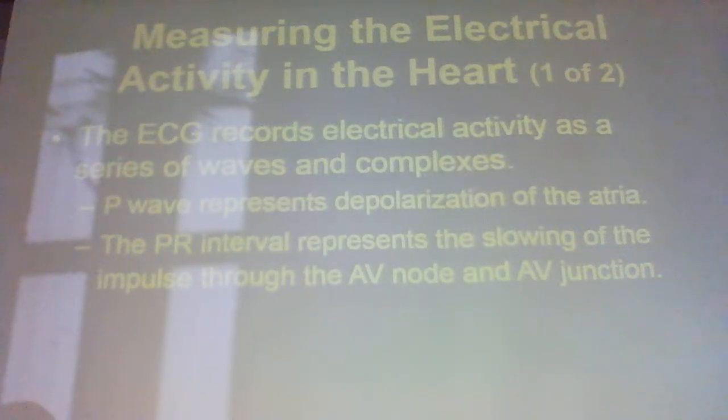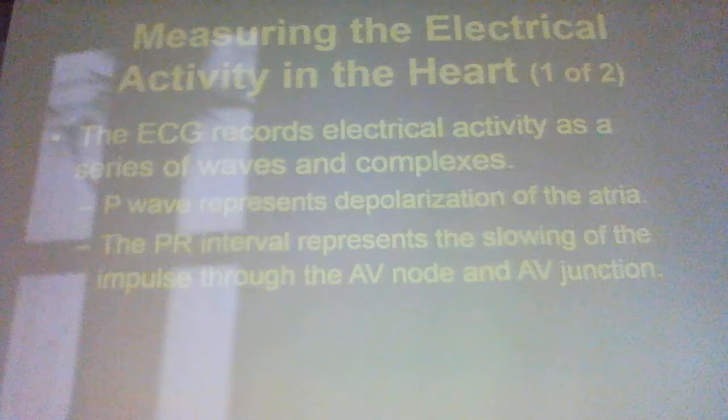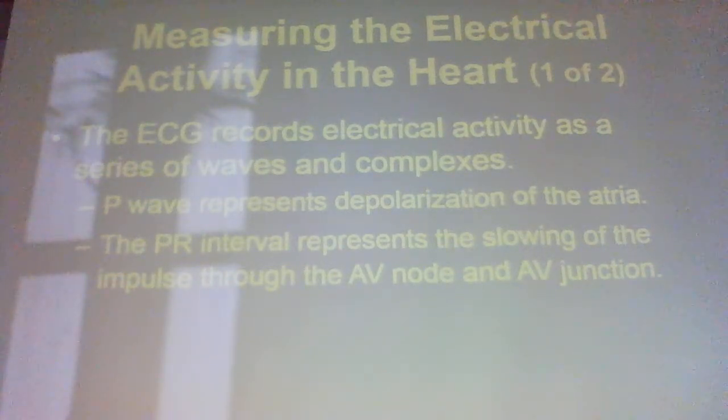So just to review that, on an EKG, the P wave represents atrial depolarization, right? And we went through what the normal P wave looks like, how big it is, and all that kind of stuff. The PR interval, what does your sheet say? It breaks it down a little more than what you learned in school. We learned that the PR interval is just the time between atrial depolarization and it getting through the AV node, right? But look at that piece of paper.